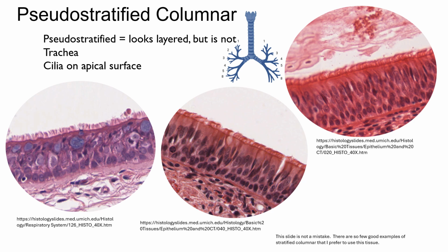These slides here are from the trachea, and they all have a feature on them that we will not see on any other epithelial cells. These all have cilia on them. Cilia are like little projections, much smaller than villi in the small intestine. And cilia all wave in a coordinated fashion. And in the trachea, they move mucus superiorly. So these cilia are kind of like a mucousy shag carpet that waves in the wind. And so to make the name of this tissue even more complicated, its name is pseudostratified ciliated columnar epithelia with mucus cells scattered between it.